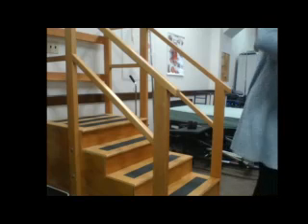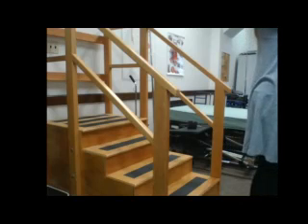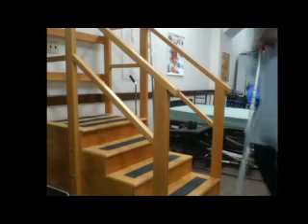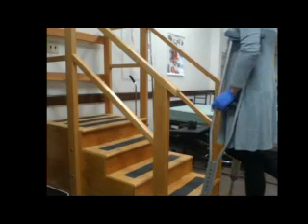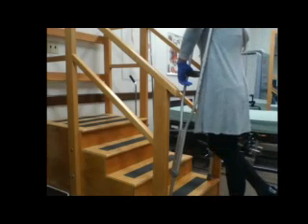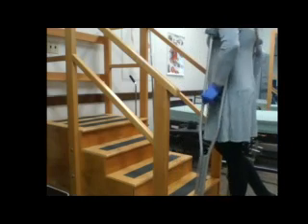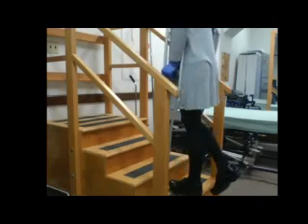Crutches are going to be slightly different. So when we're using crutches, if the person does not follow the sequencing correctly, they will know it right away. So let's say I have a fracture on my right foot. If I go up with my crutches first, does this look comfortable? Or like I'm actually going to be able to do anything? No. So, crutches will always stay lower than your foot goes up on crutches.